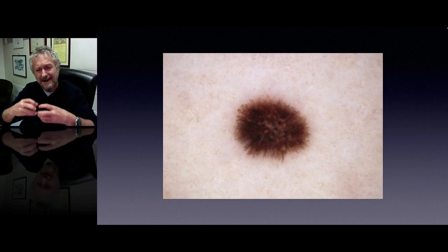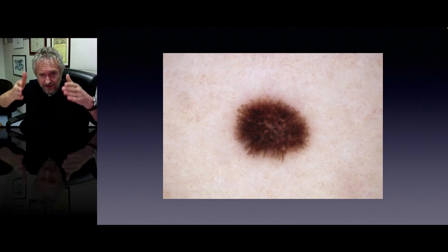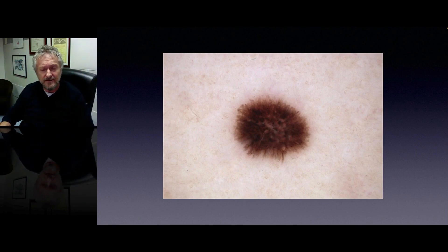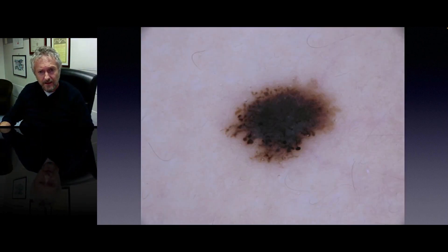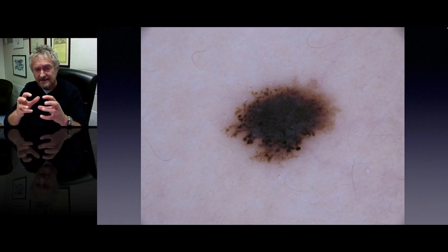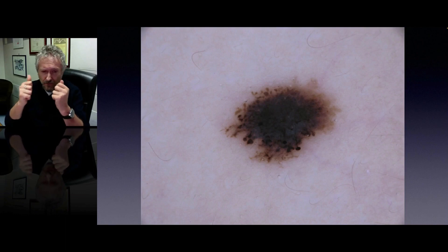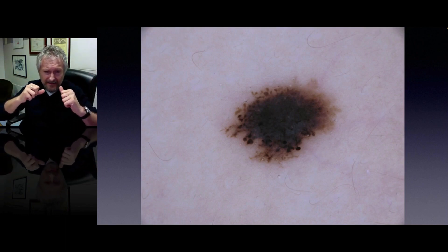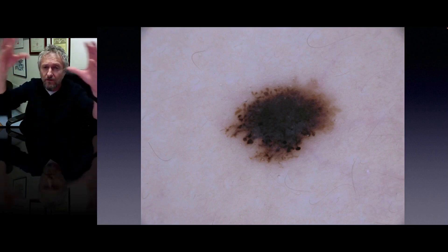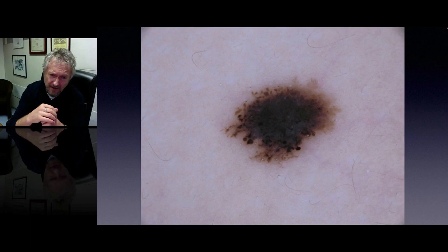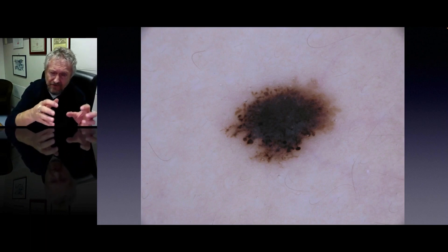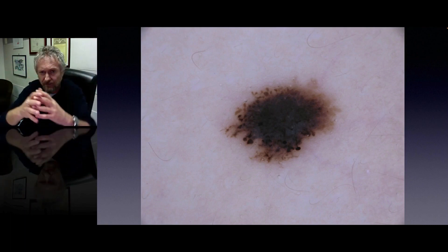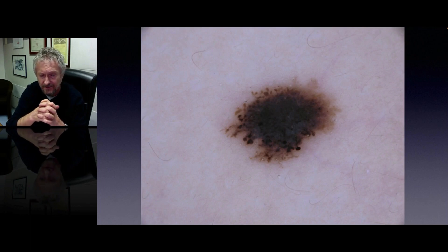Here is another example of a less pigmented lesion, but still you can see that the overall architecture is very regular and the pigmented lines are symmetrically distributed throughout the lesion. Instead, here you see more or less the same spitzoid-looking morphology with streaks in the periphery, but the streaks are not regular anymore — the overall architecture of this lesion is much more irregular. There is asymmetric distribution of the streaks, which are much more visible at the bottom side of the lesion compared to the top right side. So this was a melanoma.